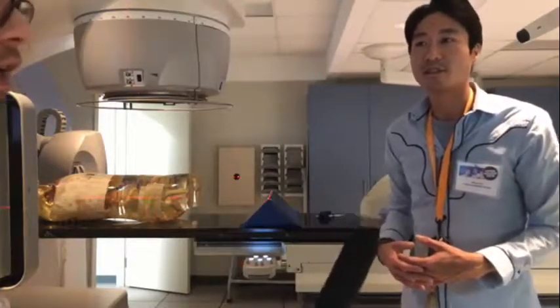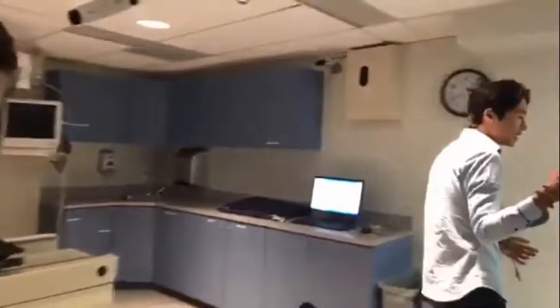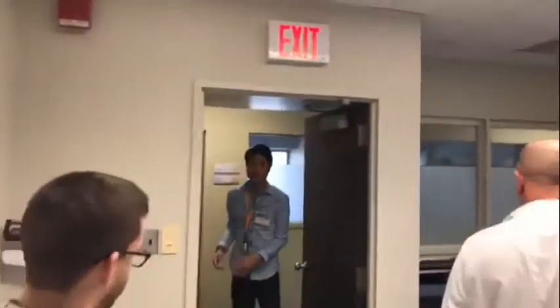Yeah. Well, while we walk, where would be the next? We're going to go to the treatment planning area. Great. So, Alfred, what would you say are the graduates, once you graduate from the program, where would you most likely be working, and what are some opportunities?